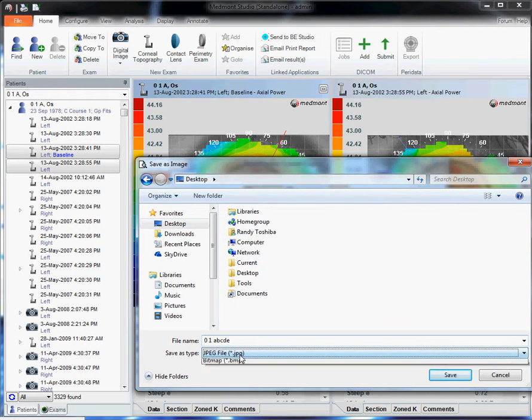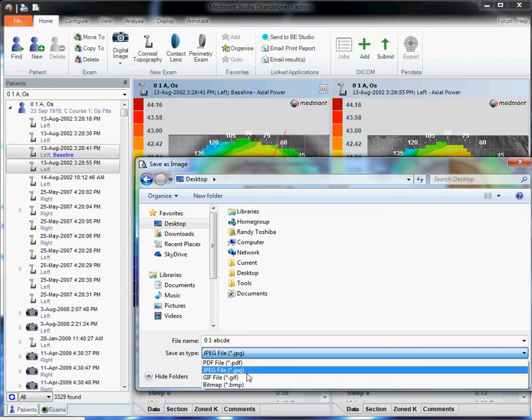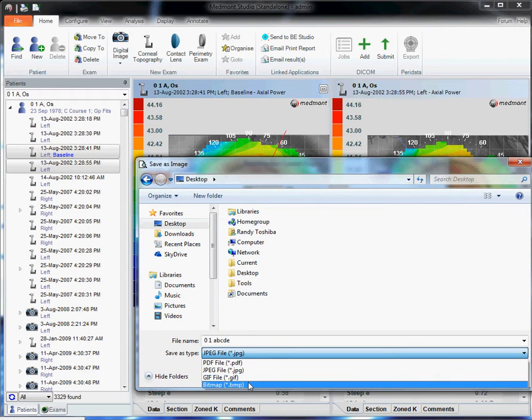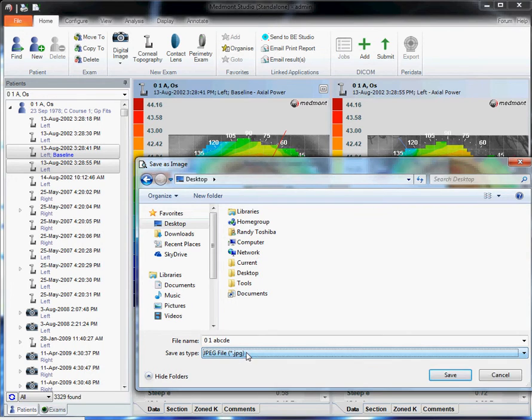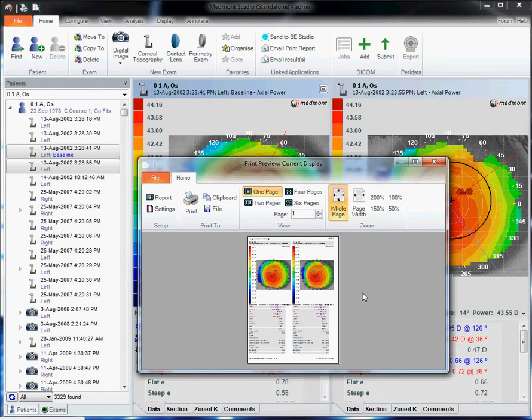Then under save as type, you have the option to save it as a PDF, a JPEG, a GIF, or a BMP. Then again, once that file is created, you can go to your email software, attach it, and email it off or copy it to a flash drive.